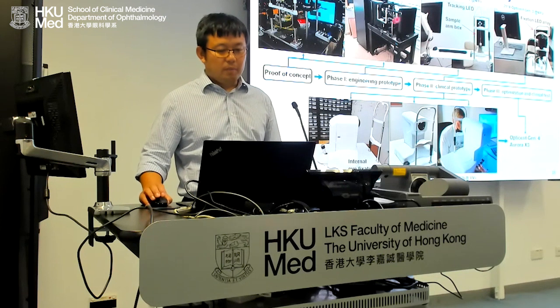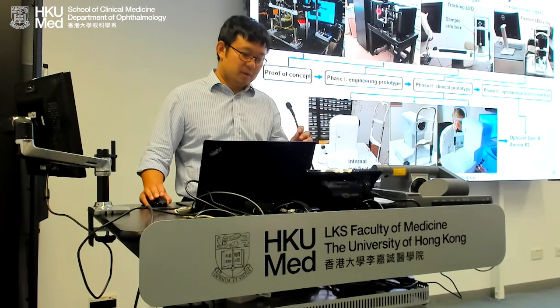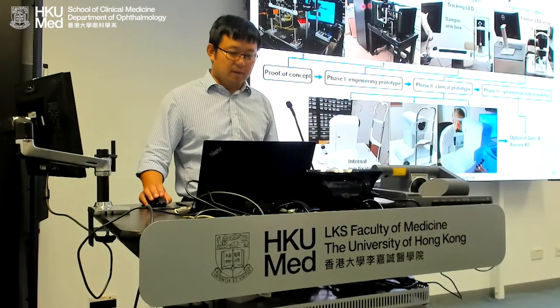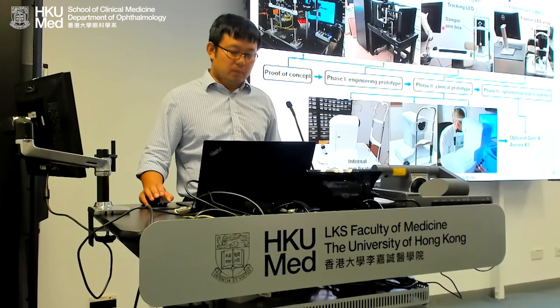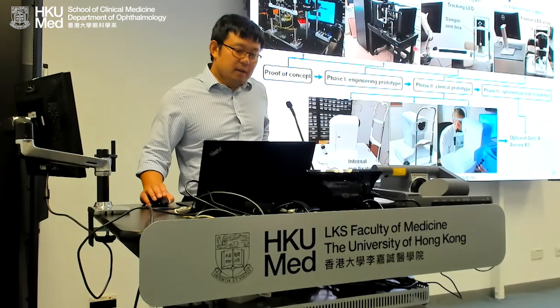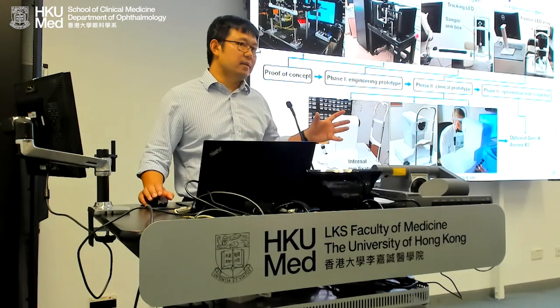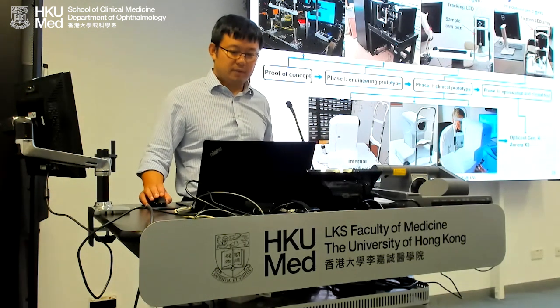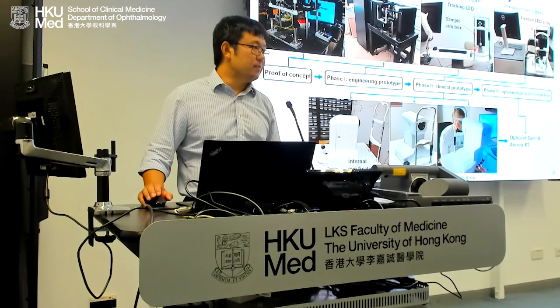Now in 2016, we packaged everything into a big cabinet and moved to Northwestern Hospital, and we let the photographer use it. It was a nightmare, and the system broke almost weekly. In 2017, I started a company, and I believe letting the company take over the engineering process while the lab focuses on the science is a better separation of focus. So this is the first prototype of the company. Still, it broke every week.